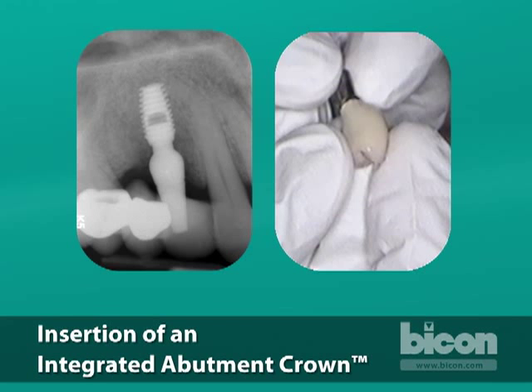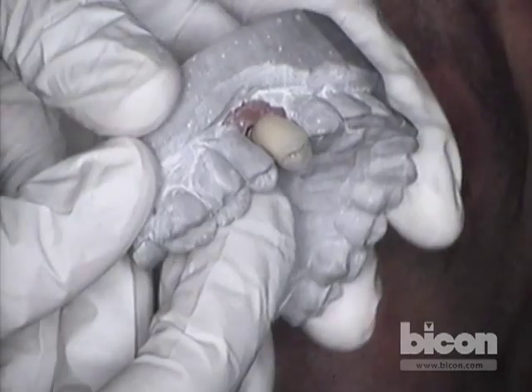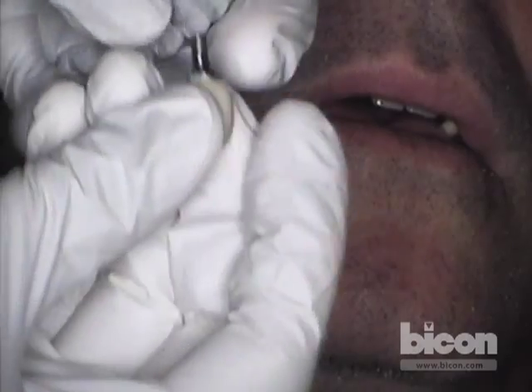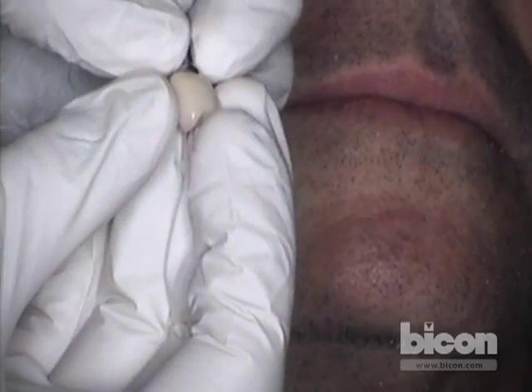Hello, I'm Reniero Ordaneta, I'm a prosthodontist. We're going to begin by showing the radiograph. We uncovered this implant and on the day of uncovering I placed a five millimeter wide by ten millimeter long shoulder abutment. Then I temporized it with a composite directly built up on top of the abutment. We're going to remove the abutment and insert the crown — this is an integrated abutment crown, ready to be inserted. The crown material is baked directly on top of the abutment, so there is no need for screws or cement.